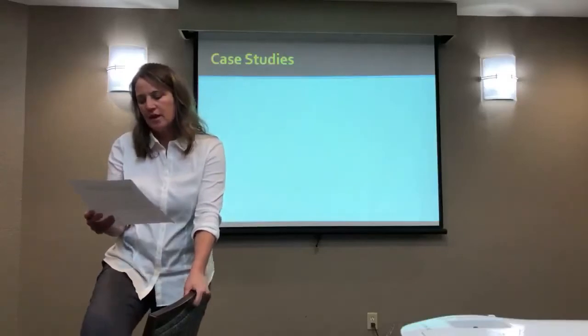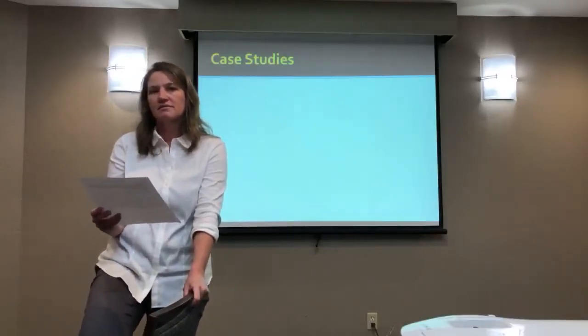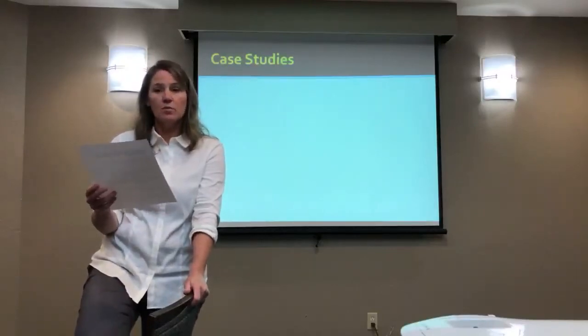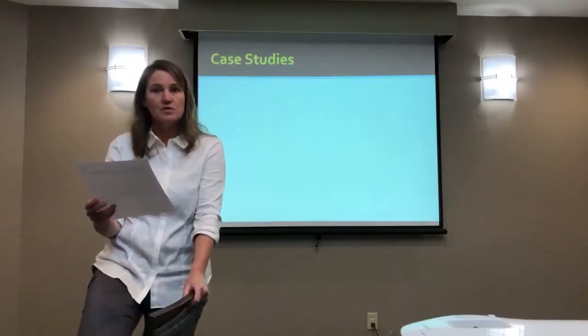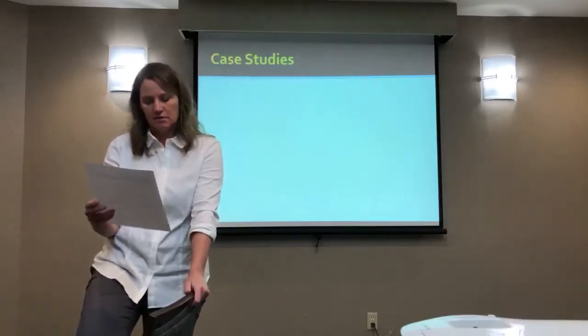So this is one that, what do you think? Is ultrasound indicated? Yeah, I think so. I mean, range of motion. All right, so you think so? And what are we gonna do? Are we gonna use continuous or pulsed? Pulsed. Okay, so pulsed. We're thinking healing but not heating. I agree.